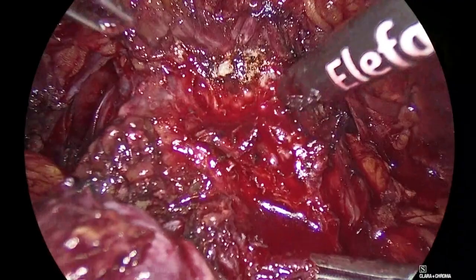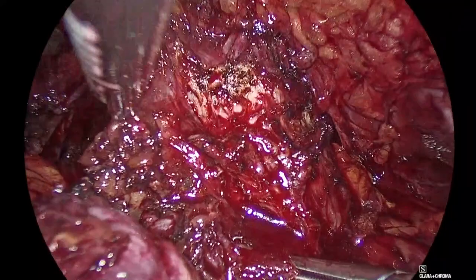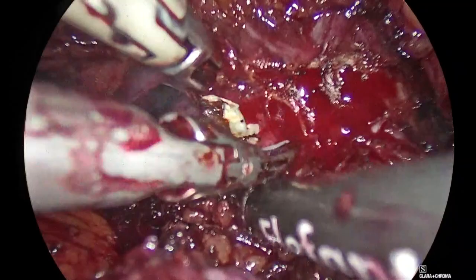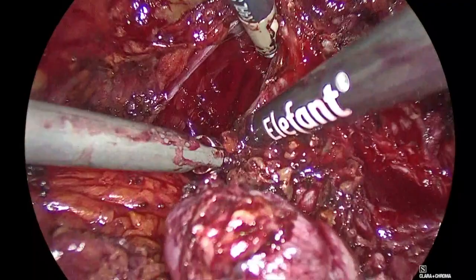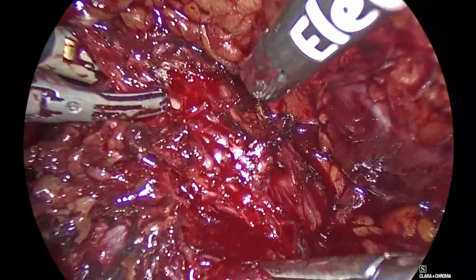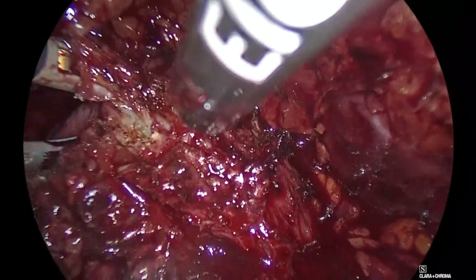Good. Here we foresee some vessels. Look, you see it? Show me. So I go here nicely. I will use the slow energy and see how it goes. Okay. Blunt dissection is also a nice way of doing it. Okay, good. Look what I'm doing now. I'm pulling with my grasper. I'm pushing the apex for hemostasis. So now I'm continuing here the dissection. Good. Other side. You see that? How it stops immediately.